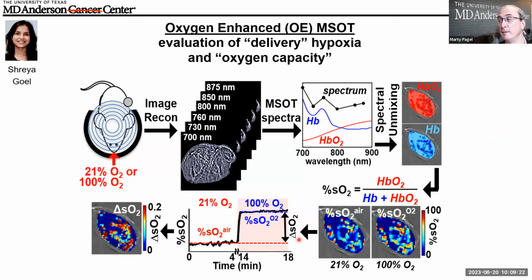And there are limitations to photoacoustic imaging, or MSOT. It's only about 3 centimeters deep into the mouse or the patient, but yet it is a pretty intriguing technique that can give you a unique biomarker that can't be done with many other techniques very easily.